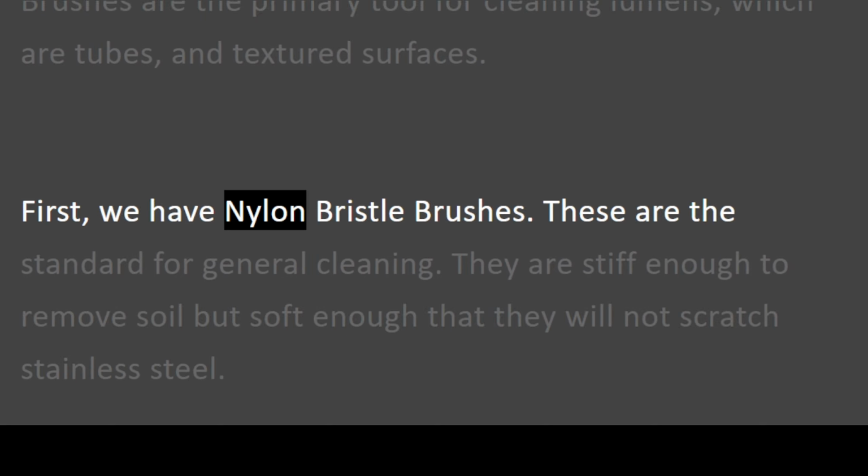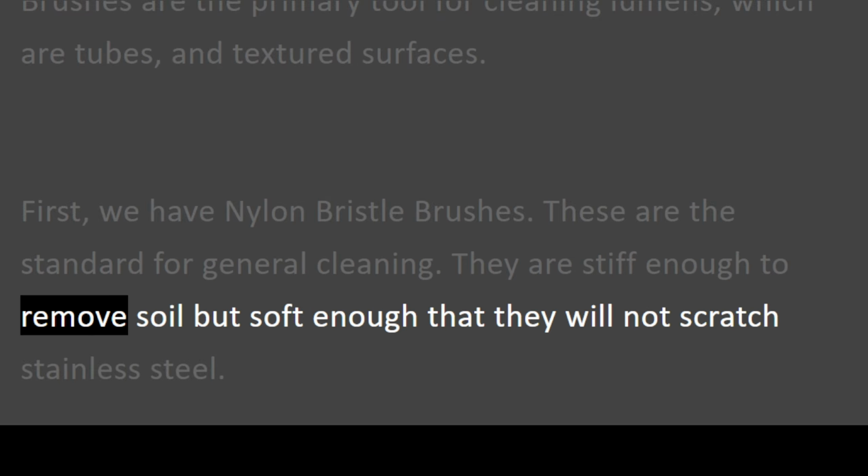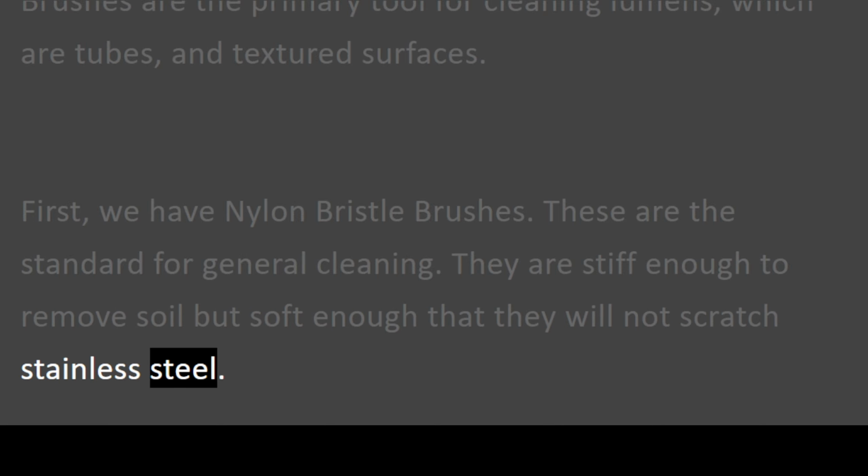Brushes are the primary tool for cleaning lumens, which are tubes and textured surfaces. First, we have nylon bristle brushes. These are the standard for general cleaning. They are stiff enough to remove soil but soft enough that they will not scratch stainless steel.